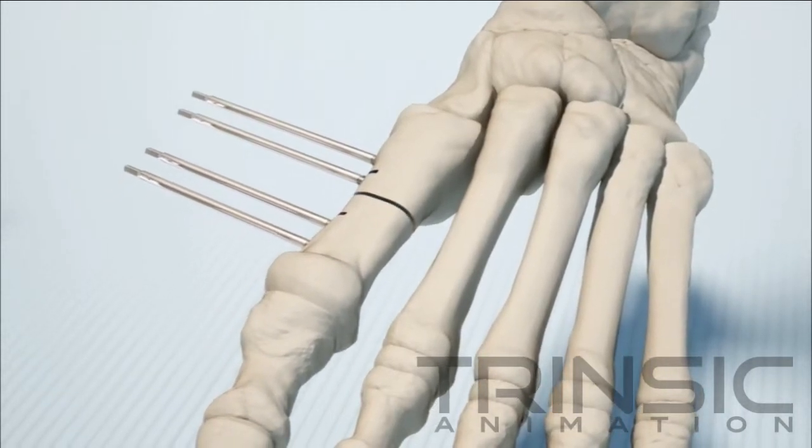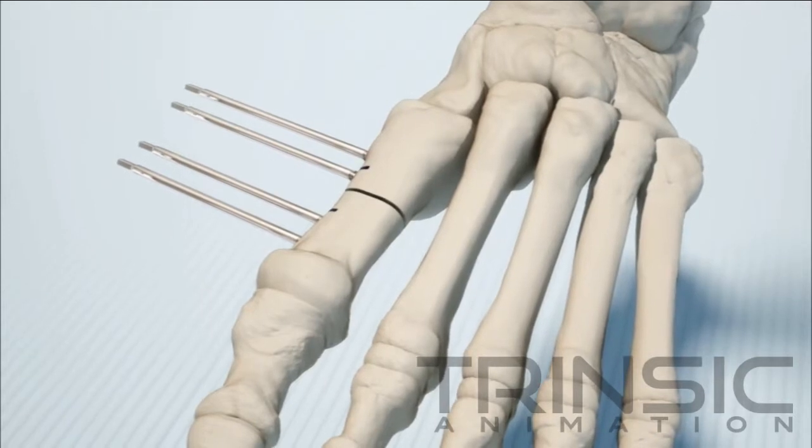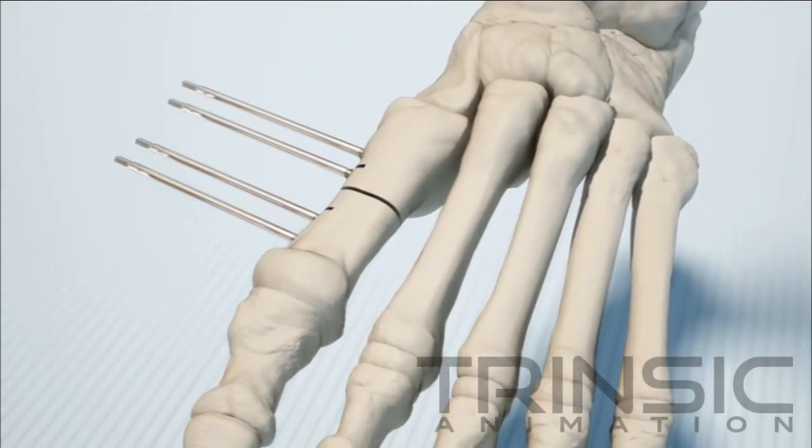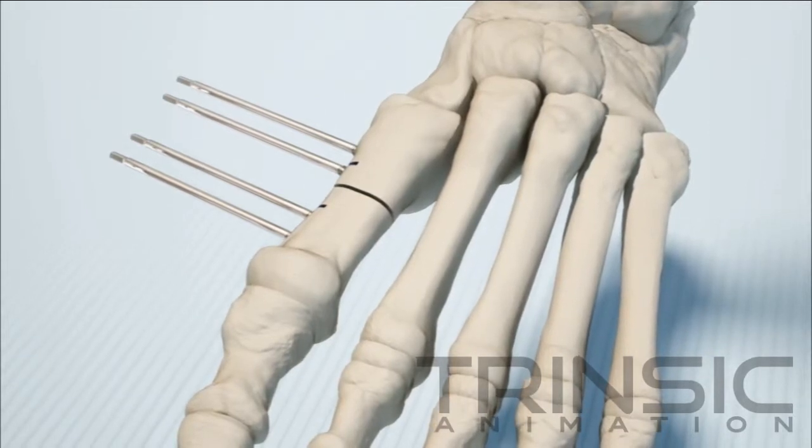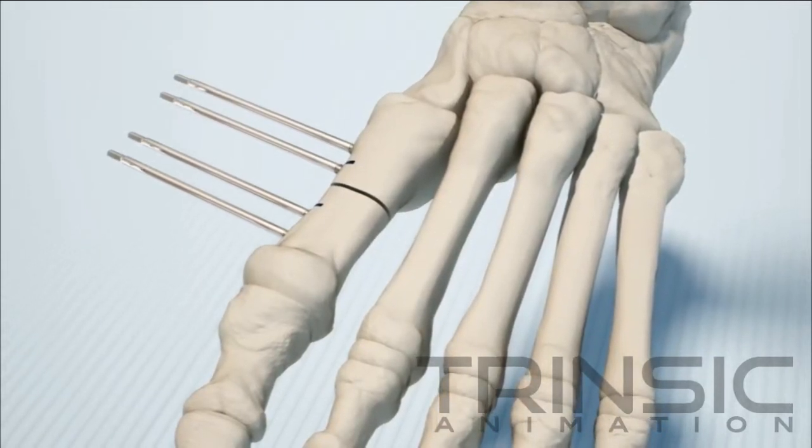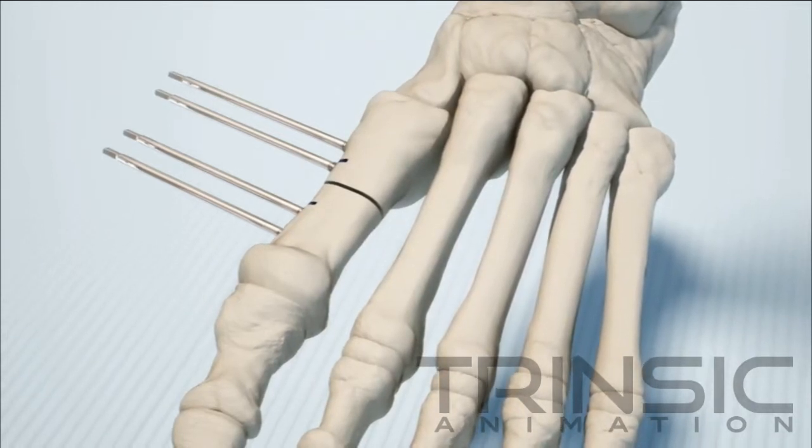With an osteotome, make sure the distal fragment is totally free. Notice that the pins are introduced first before making the mid-shaft cut. This will ensure that the compression and distraction of the two fragments will remain co-linear without any dorsiflexion or plantarflexion.